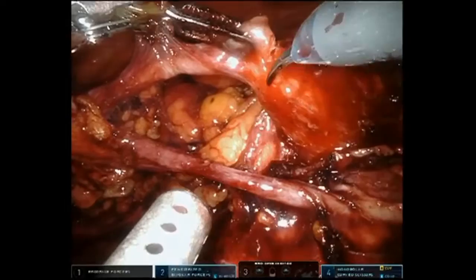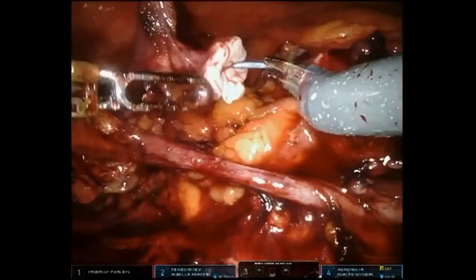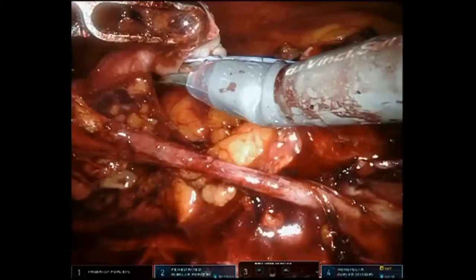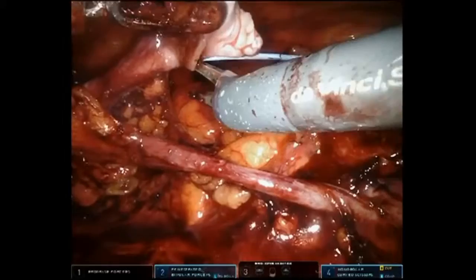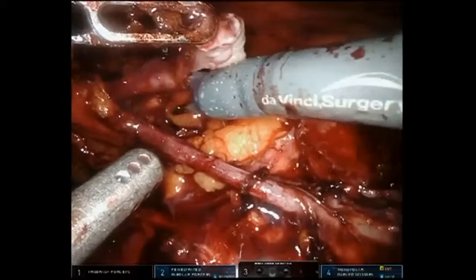Obstruction was identified. No crossing vessel was present, but an internal narrowing was evident. The bedside assistant performed a flexible cystoscopy and advanced a sensor wire up the right ureter for approximately 30 centimeters until resistance was met. The UPJ was dismembered and the ureter was spatulated posteriorly. It became quickly evident that the narrowing was not isolated to just the UPJ, but rather the patient had a long proximal ureteral stricture.